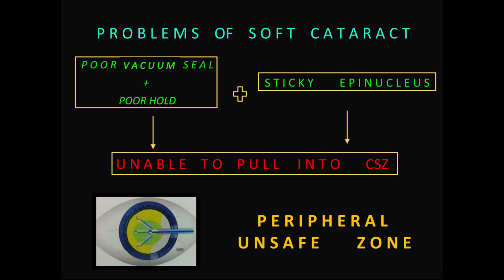Also in soft cataract, the nucleus and epinucleus are very sticky. The epinucleus adheres to the nuclear surface very strongly, so much so that you are unable to pull the nucleus into the central safe zone. As a result, you tend to suck out the nucleus into the peripheral unsafe zone, where it is in close proximity to the posterior capsule, and you may end up with a posterior capsular rupture.